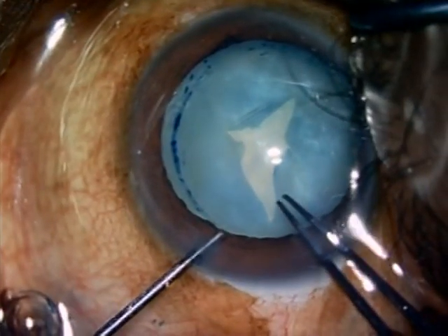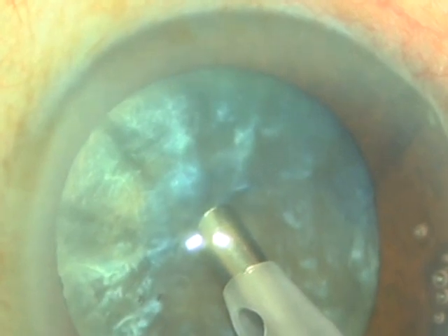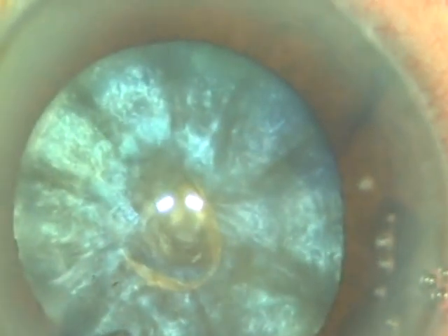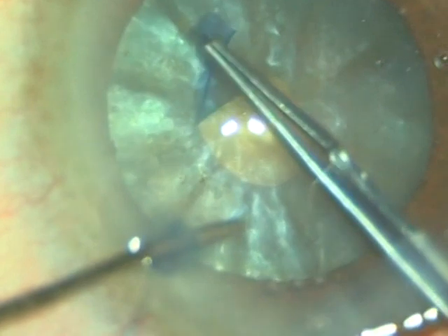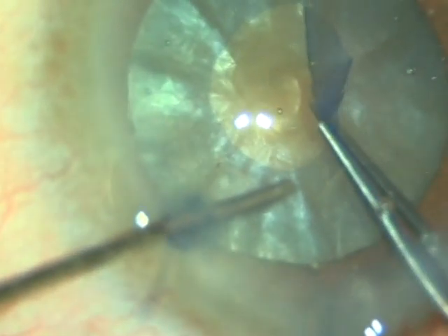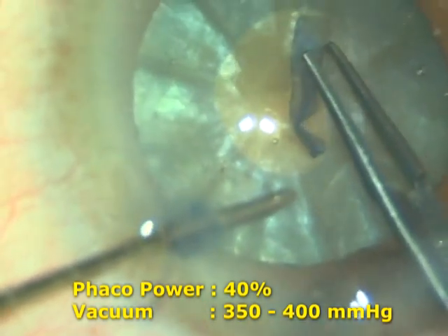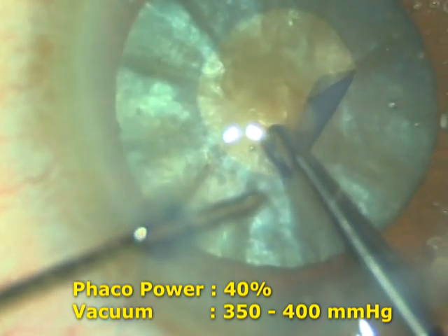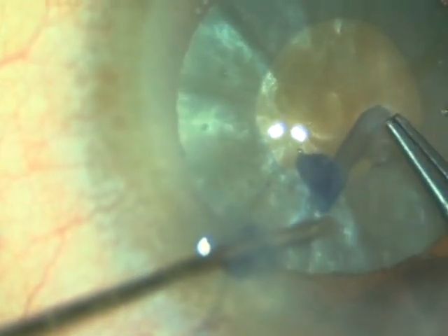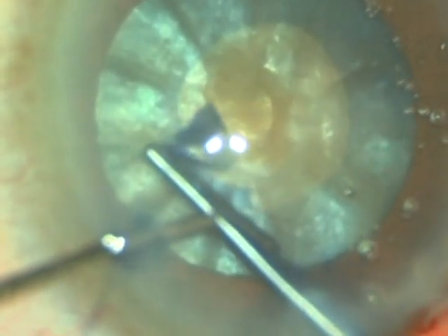To prevent this Argentina flag sign, I developed a technique called the panchorexis. A straight tip, either 15-degree or 0-degree, with bevel down, is directed towards the center of the anterior capsule. A sudden burst of phaco emulsification — approximately 40% power in a vacuum of around 350 to 400 mmHg — is given. Because of this sudden burst of phaco emulsification, there is sudden decompression of the bag, and the Argentina flag sign does not occur.